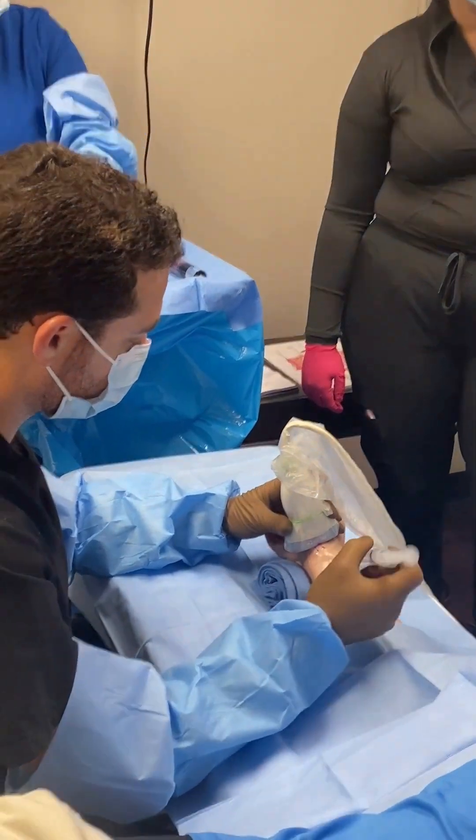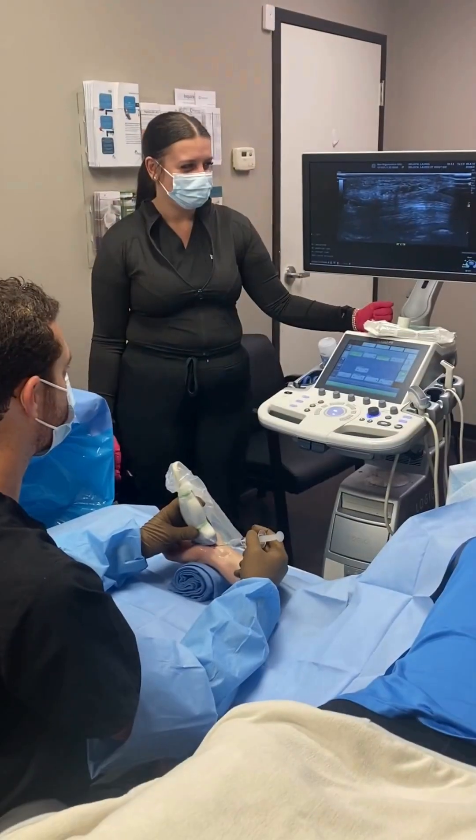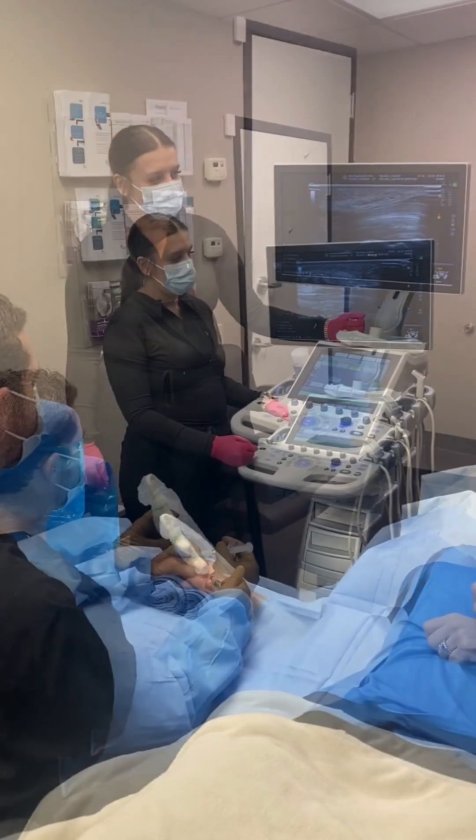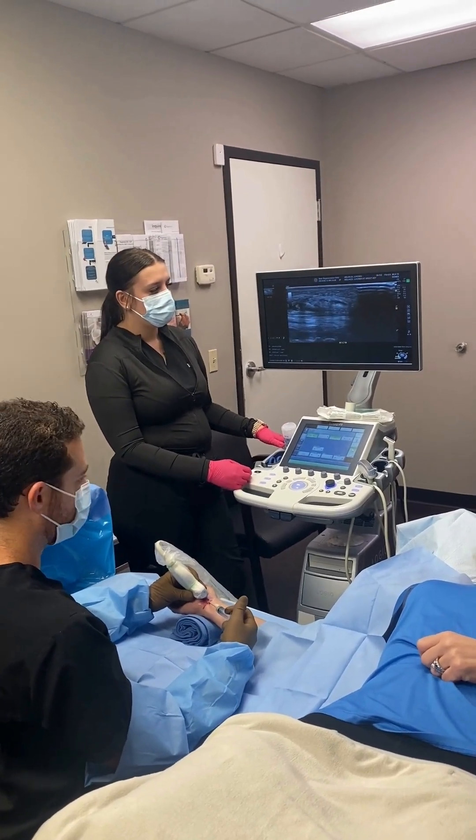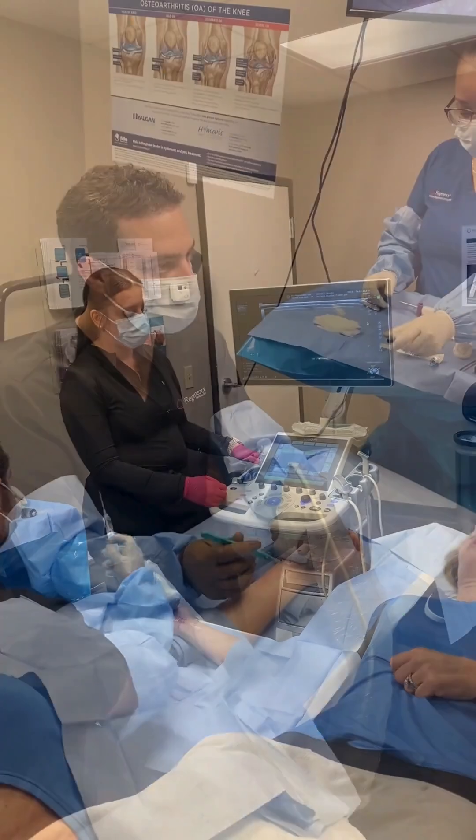After that we numb up the area including some of the deeper structures in the wrist. The patient just feels a little bit of a poke and a burn and doesn't feel anything for the rest of the procedure.